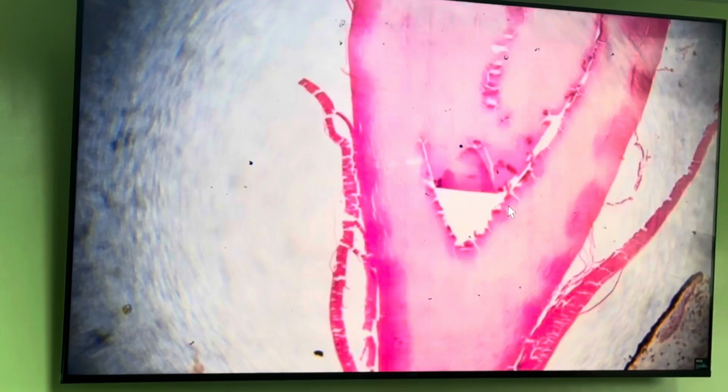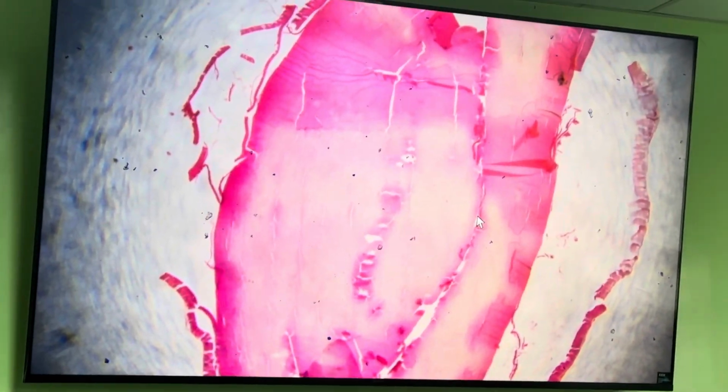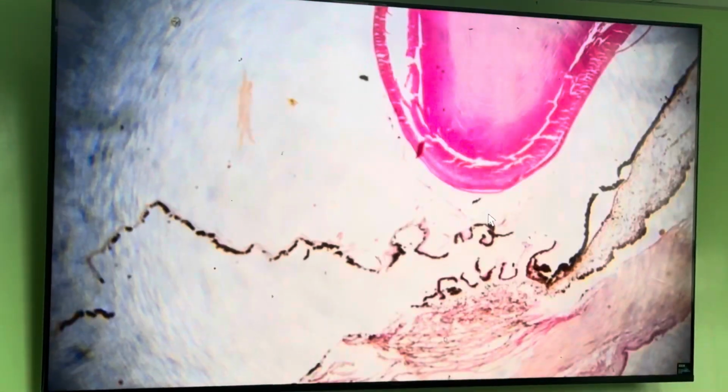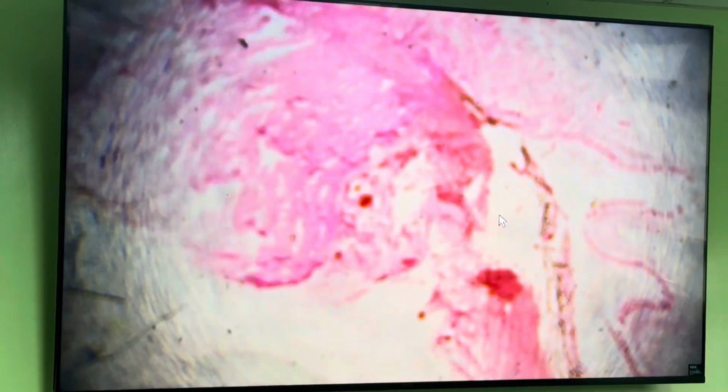So as you can see, the organization of this particular slide is different from that one, in a sense that you do not see clearly the cornea. Okay? This is actually the cornea, but it has a different color. So this would be the iris, this would be the lens, the ciliary body. We have the choroid, which is easily identifiable because of its color.